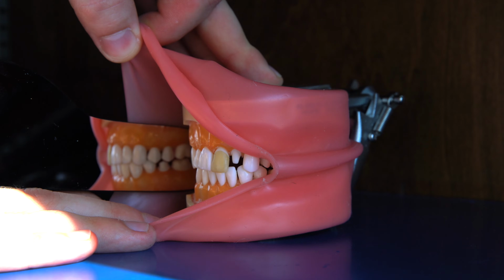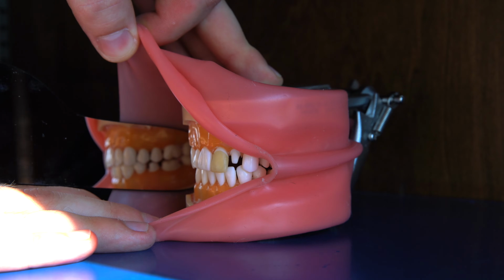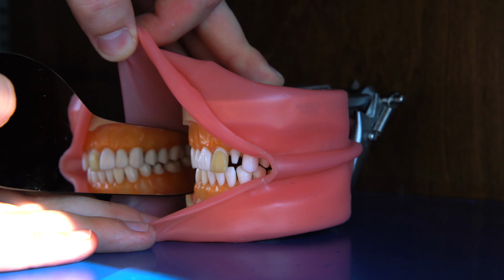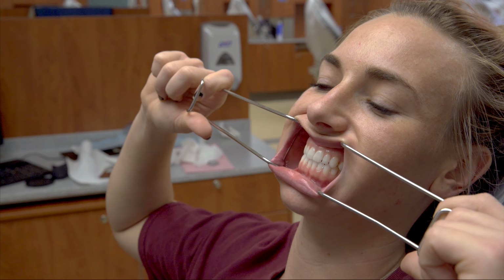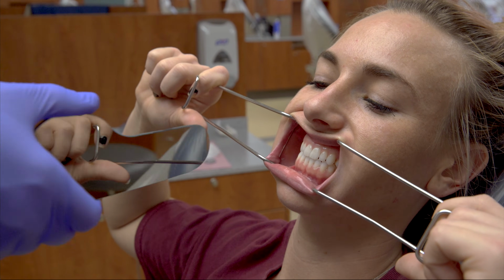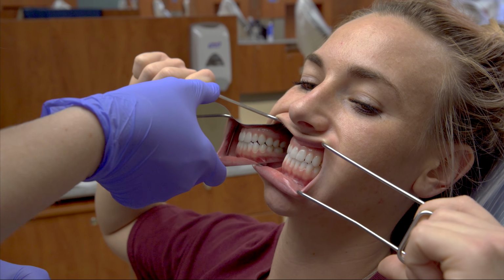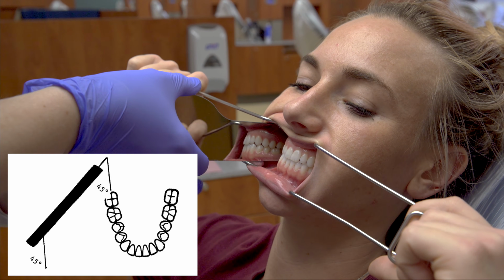Once the retractors have been placed, it's easiest if the patient holds the retractors so that the assistant can hold the mirror. Mirror retraction for this photograph can be tricky. We obey the rule of 45 and 45. The mirror should slip in the vestibules parallel to the teeth. Then the assistant moves the mirror to a 45-degree angle to the teeth.